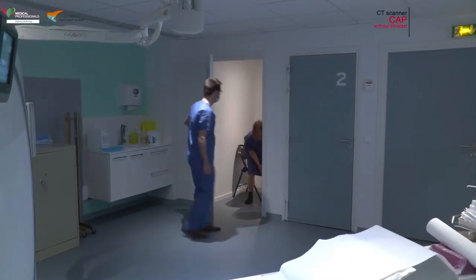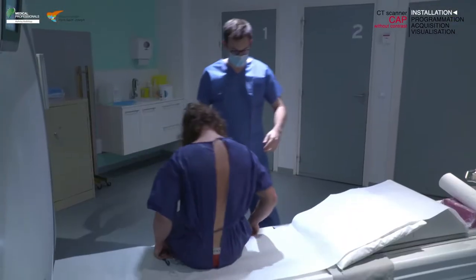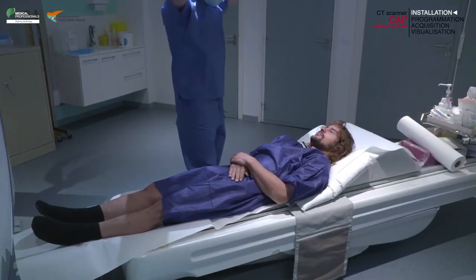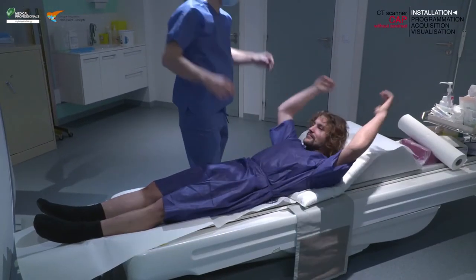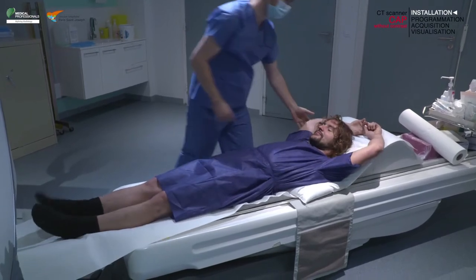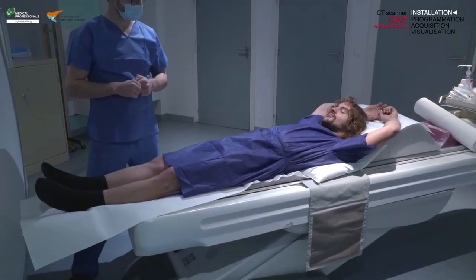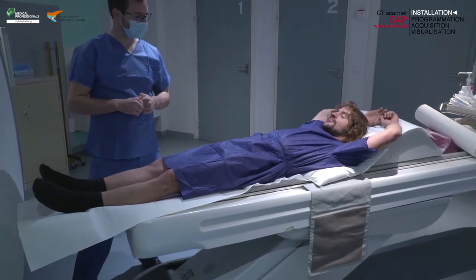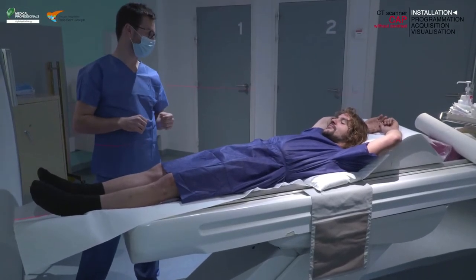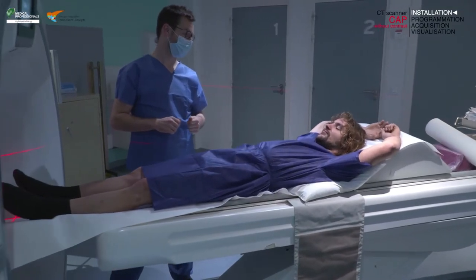After verifying the patient's identity using at least two identifiers, such as first name and last name or date of birth, place your patient in a supine position with their arms above the head. For the patient's comfort, place a pillow or an incline plane under the patient's head. You can also place leg elevation pillows under the patient's knees.